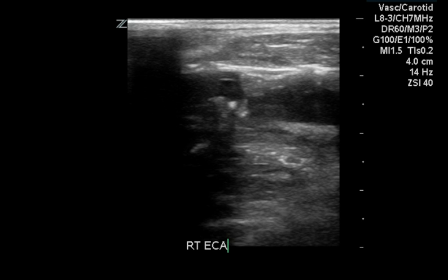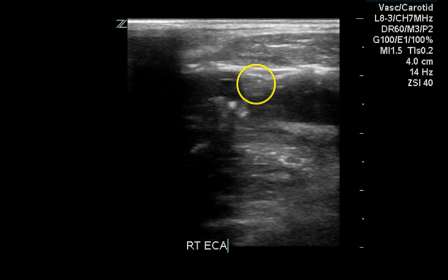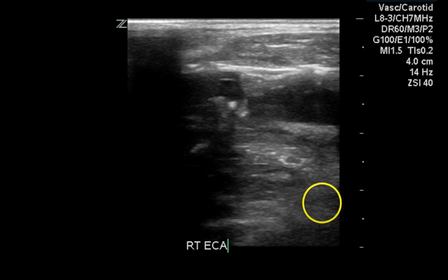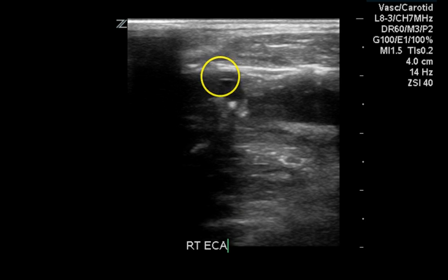This is the right external carotid artery at its origin. We see a small amount of non-shadowing plaque in the distal common carotid artery, and then some calcific plaque at the origin of the external carotid artery, along with some non-shadowing plaque as well.